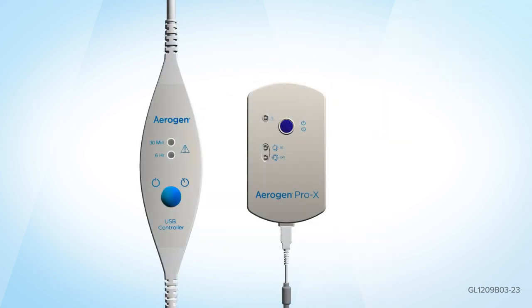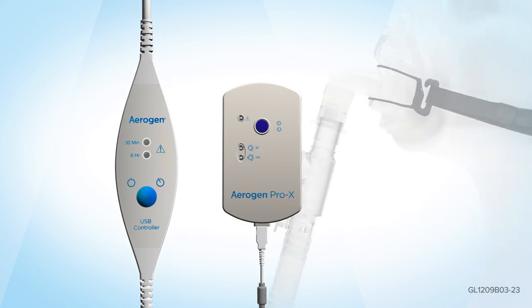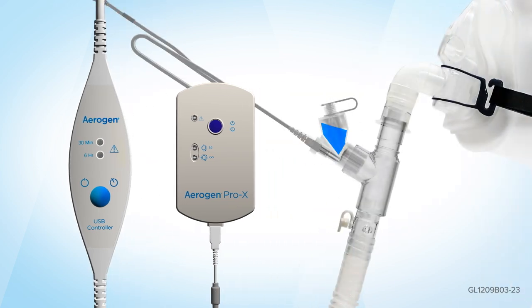Connect either the Aerogen Prox controller or Aerogen USB controller cable to the Aerogen Solo.